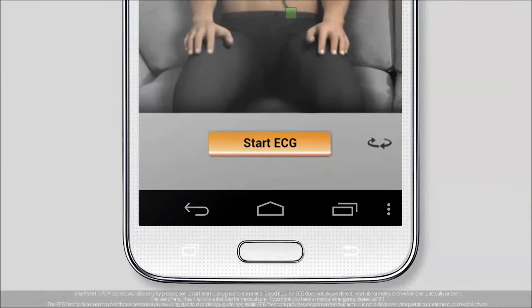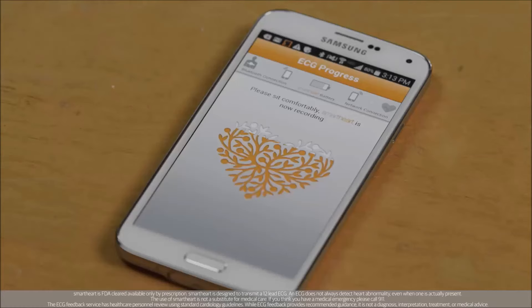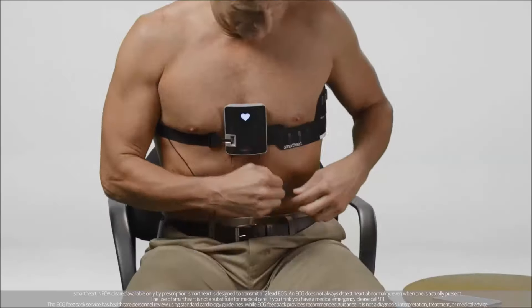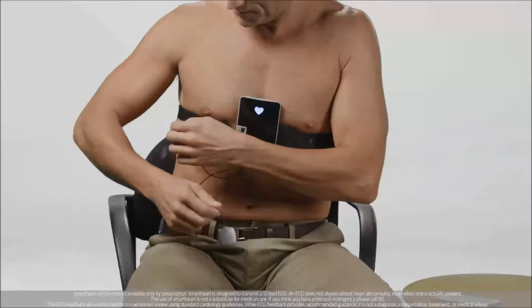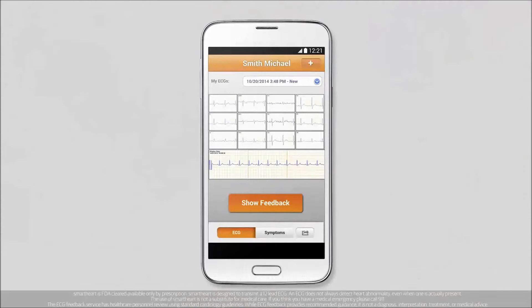Tap the Start ECG button on the app. Ensure you're completely still while performing the test. When the ECG is complete, a voice prompt will say you can remove the device. Your ECG is done. You can now take off your SmartHeart from your body. After about 30 seconds, a complete ECG graph will appear on your mobile device.